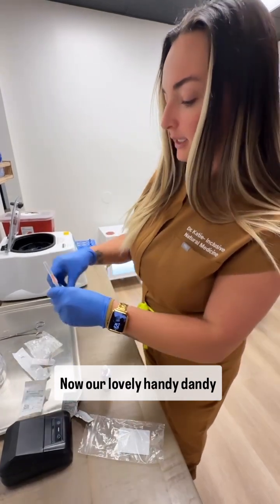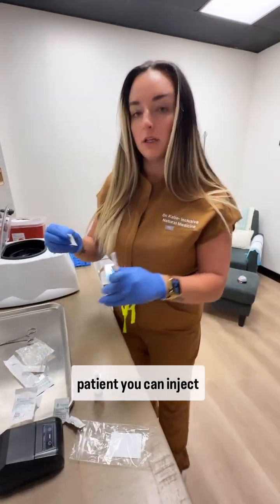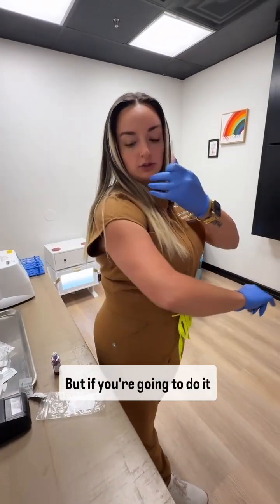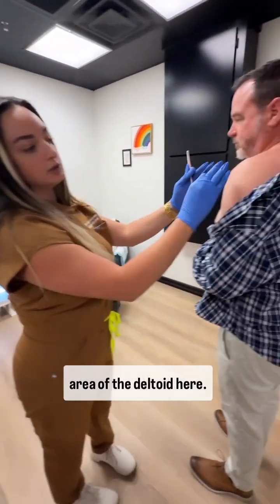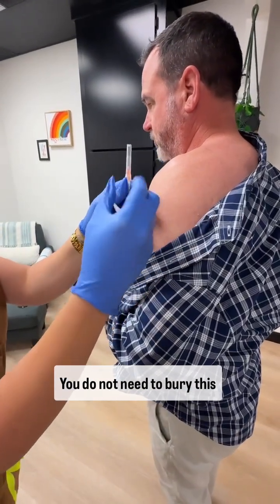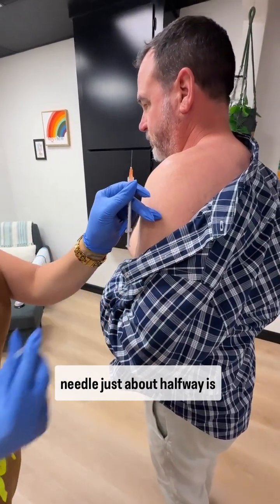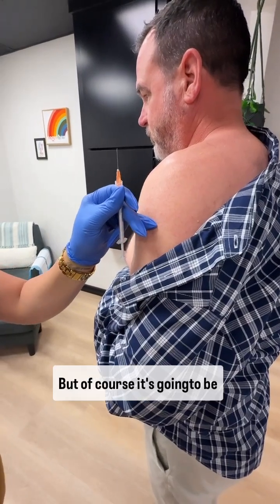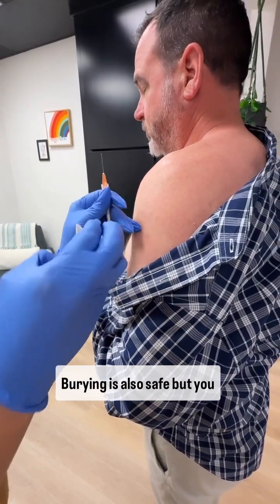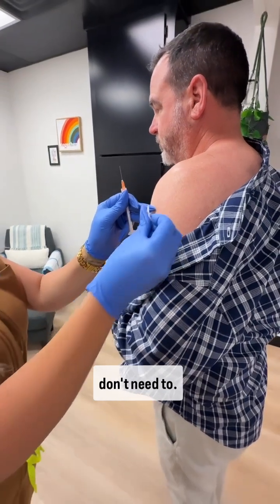Now, our lovely handy dandy patient, you can inject testosterone by yourself. You don't need someone to do it. But if you're going to do it, then you want to focus on the area of the deltoid here. So this whole muscle, anywhere in here is nice and safe. You do not need to bury this needle. Just about halfway is fine. But of course, it's going to be difficult to tell, you know, are you this far or this far? Burying is also safe, but you don't need to.